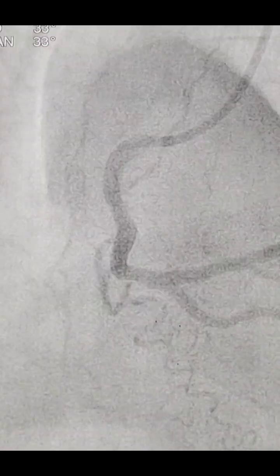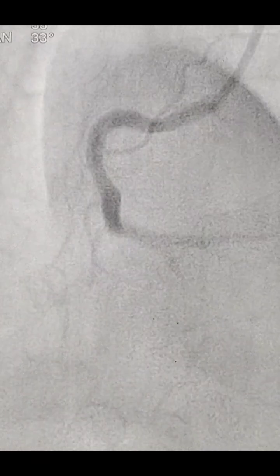You can see clearly in this plain scene, the stent is moving up and down, and now it looks good. Now in this last scene, it is very stable, and that was due to the bend only.